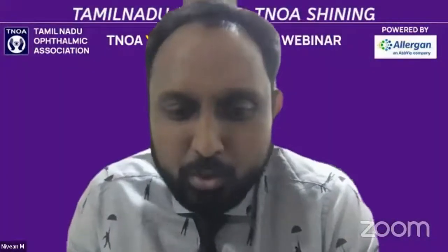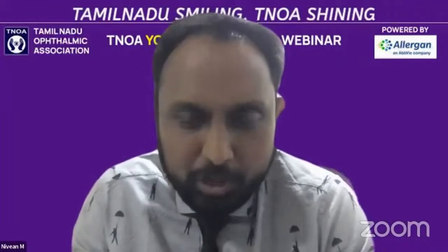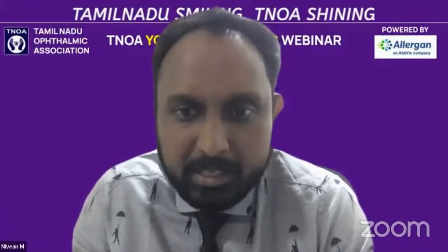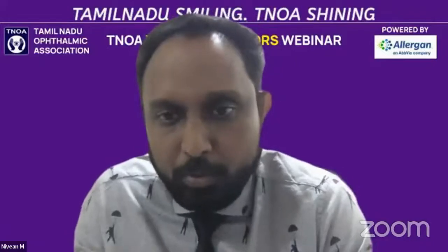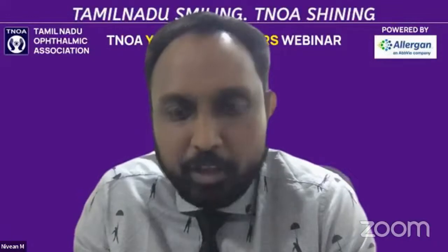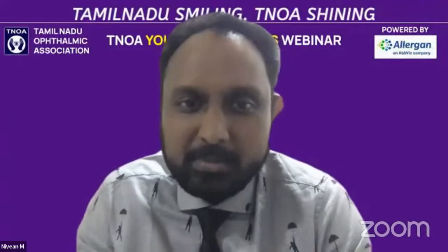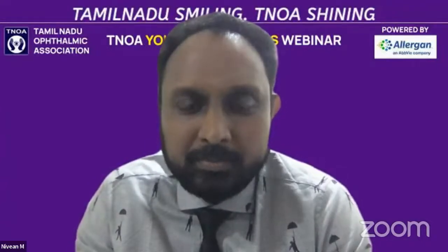Right now, we have done only 2 cases where we have made the sclerostomy slightly closer. And also we can go vertical if the vertical diameter is less. Hypermetropes, we can go up to 2 millimeters. So we're only altering the length of the sclerostomy right now. But they said if at all we have extreme eyes, the lens can be customized. The whole problem is getting a mold to make a different size lens is becoming difficult or more expensive.